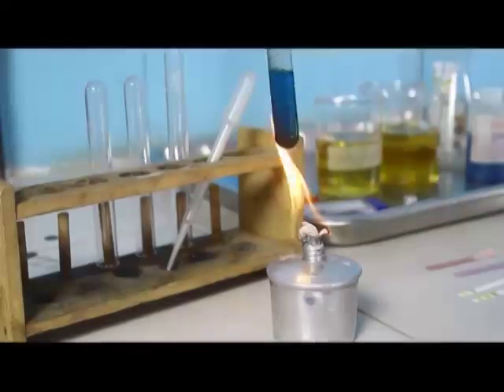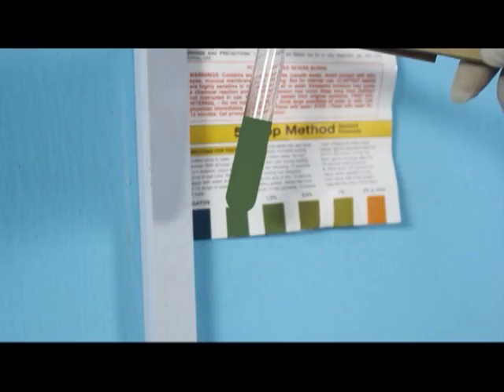If glucose is present, the color changes to green, yellow, or brick red.